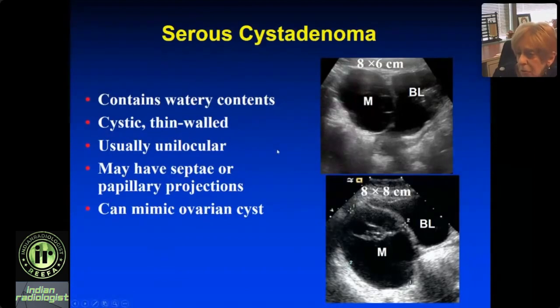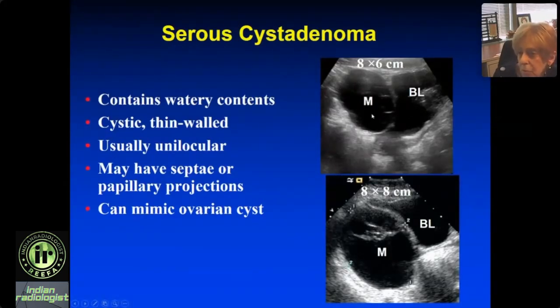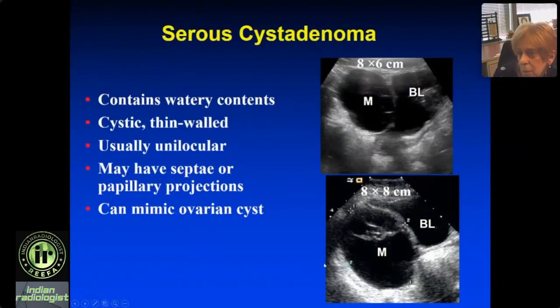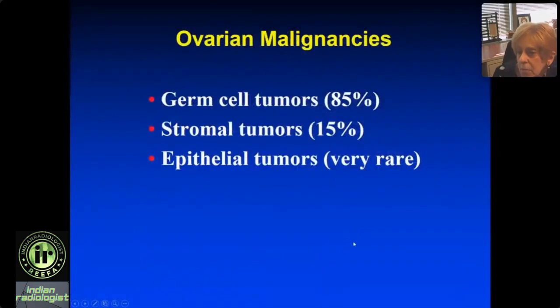The serous cystadenoma contains watery contents with a thin wall, and occasionally you see a few septations. This patient had pain and here's the mass — it looks like an adnexal cyst, it's big. We brought this patient back and it never got smaller, so they went to surgery — it was a serous cystadenoma. Here's another one: a huge mass with a few septations, brought back once or twice, never got smaller — also a serous cystadenoma.